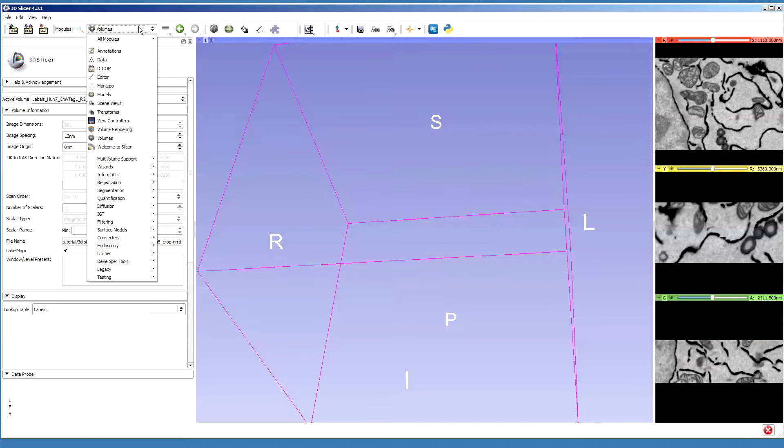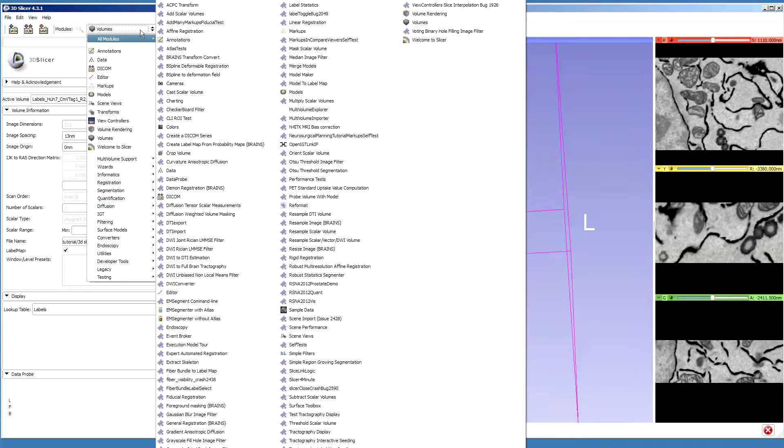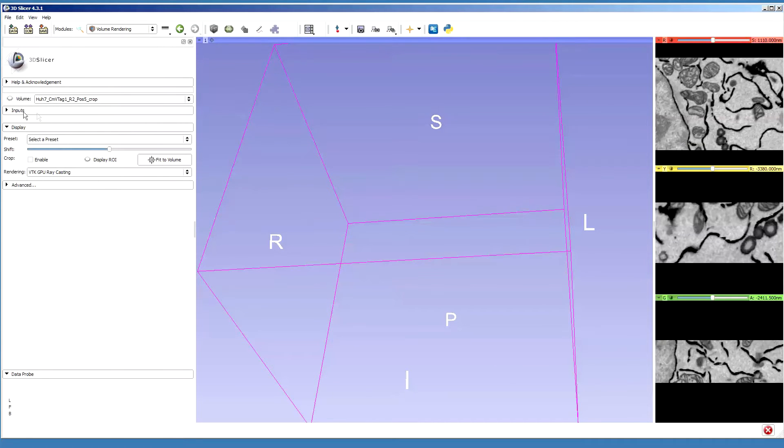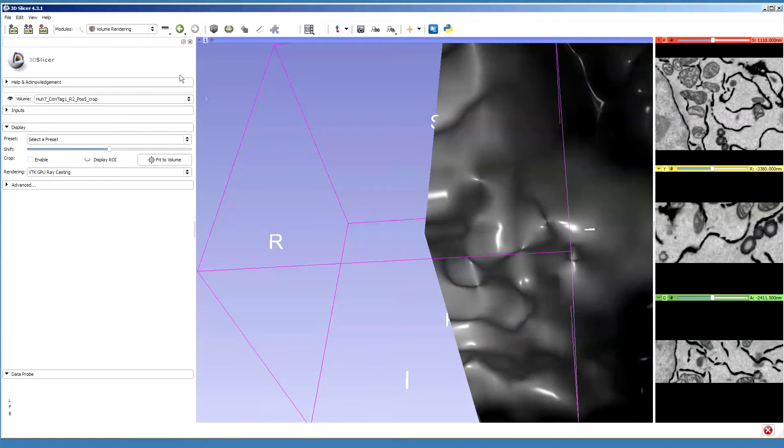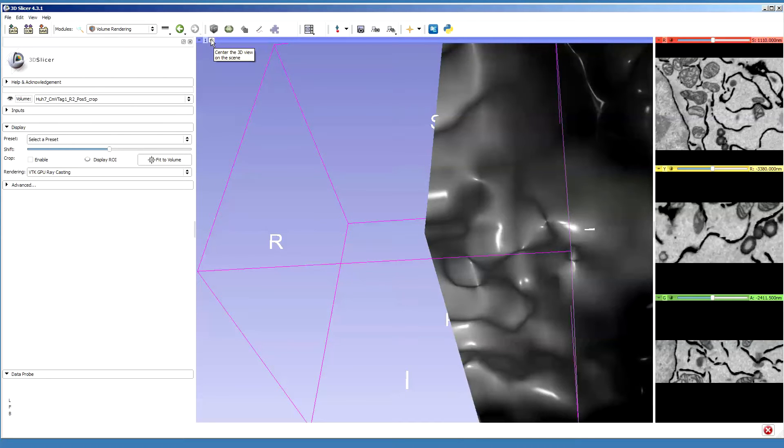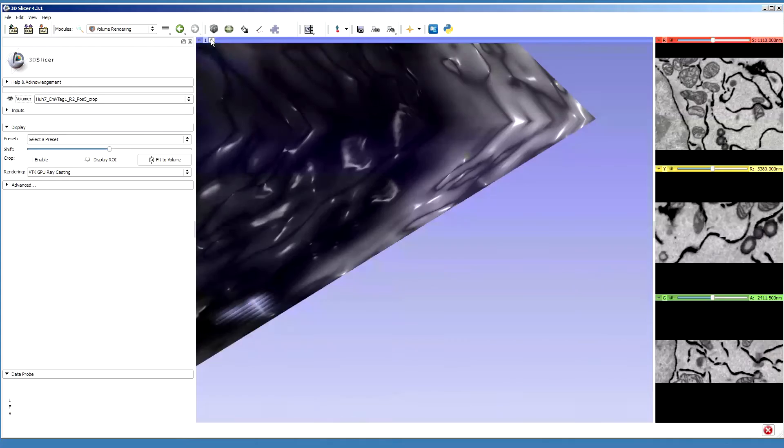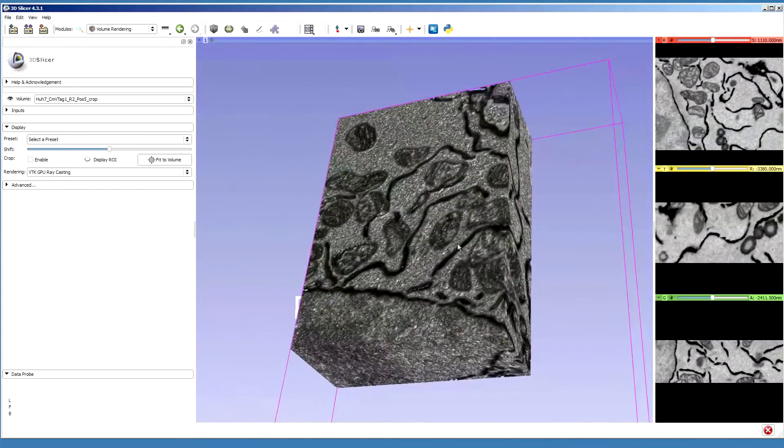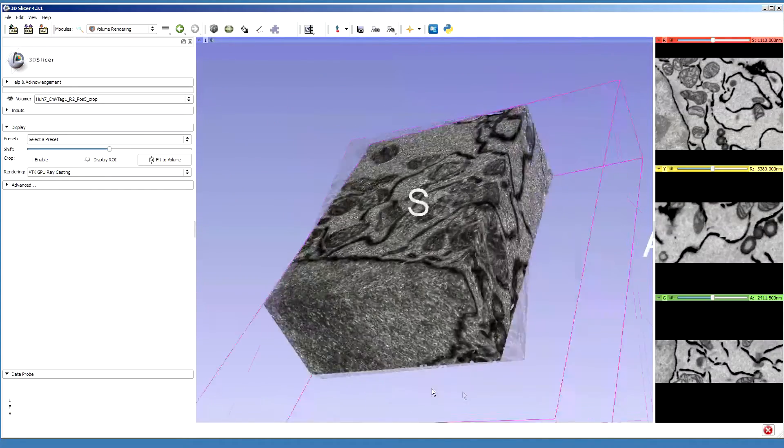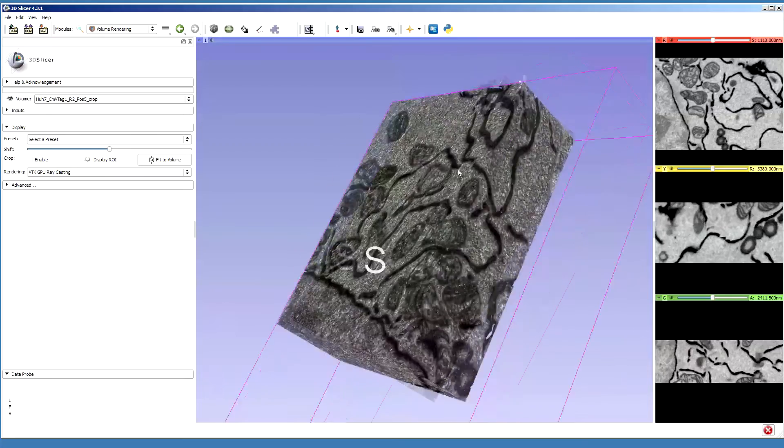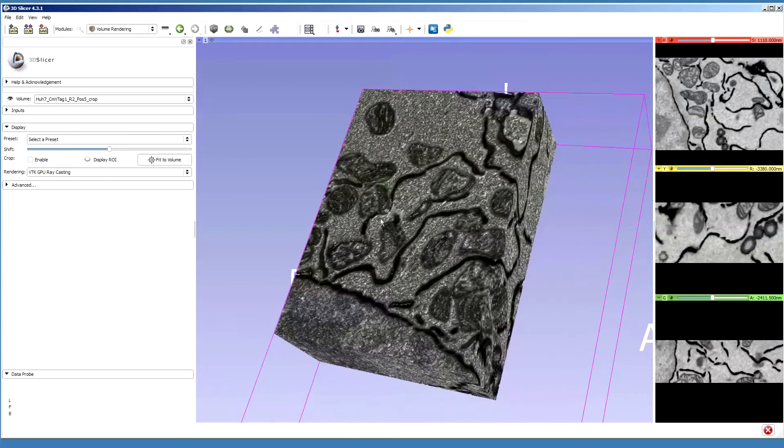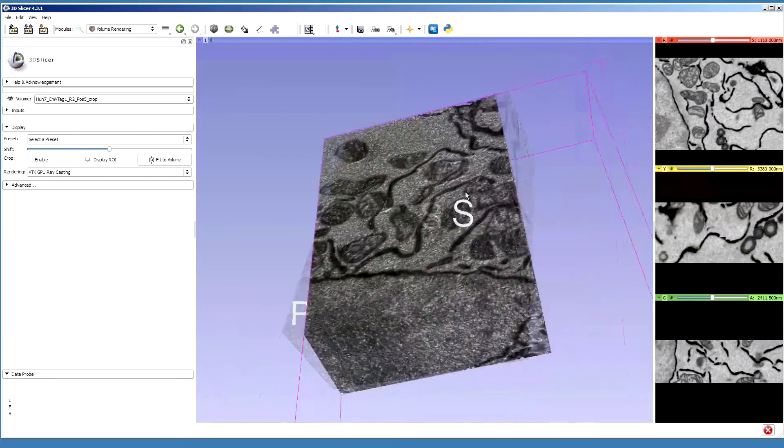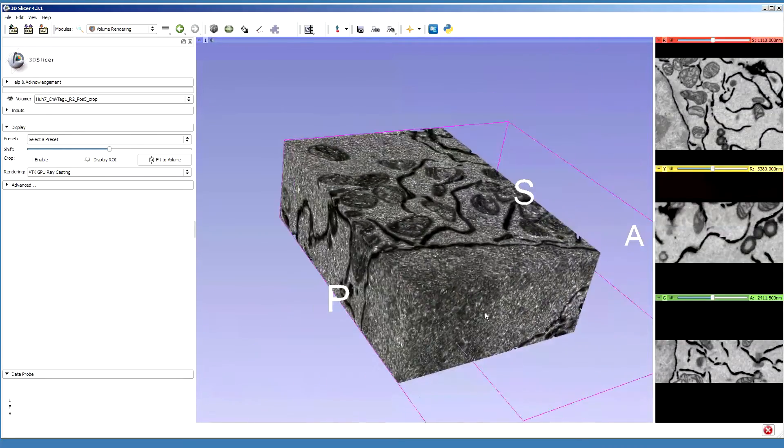Let's try to visualize this. The first thing to try is volume rendering. It can be selected from this list, and in order to see the dataset we need to click on this volume, there's a closed eye button, and then I select this fit or center 3D view on the scene button. So this is our volume.